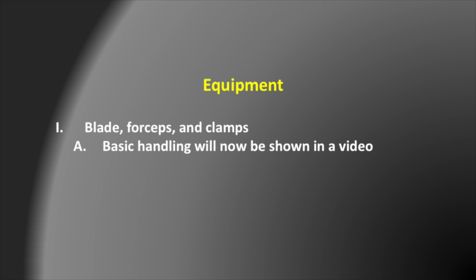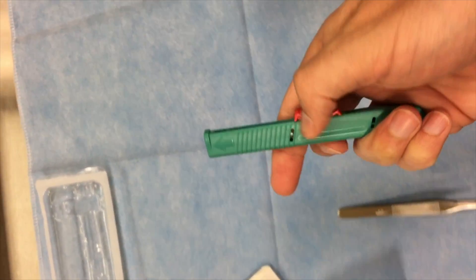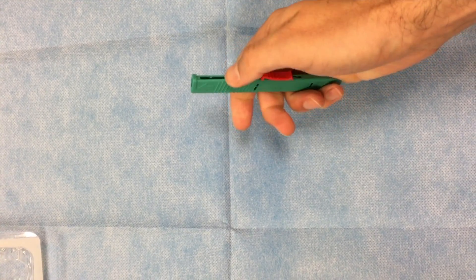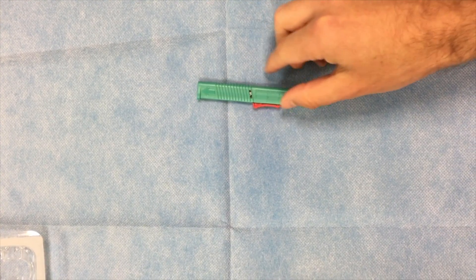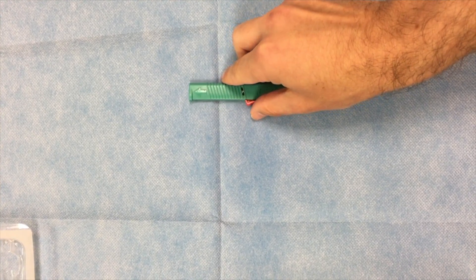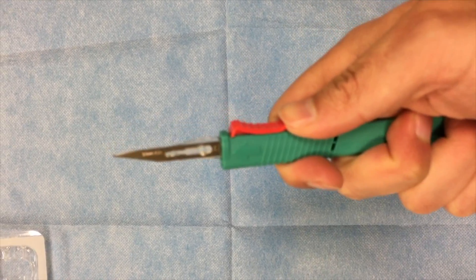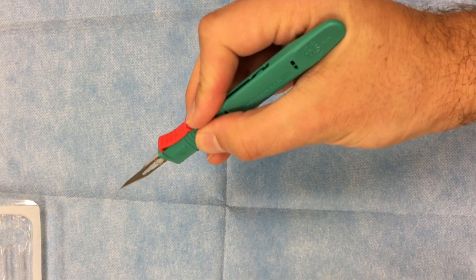We're now going to review how to use a couple of common tools in IR, which include the blade, forceps, and clamps. I'm going to show a few videos of basic handling. This is an example of a blade. There are lots of ways you can potentially hold this — some people will grab it like this, some people will try to grab it underneath. The correct way that it's taught is to imagine it's a pencil: just pick it up like a pencil. This will release the sharp end and give you the most control.